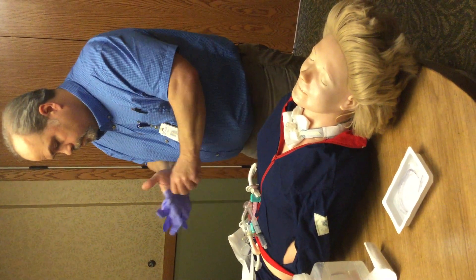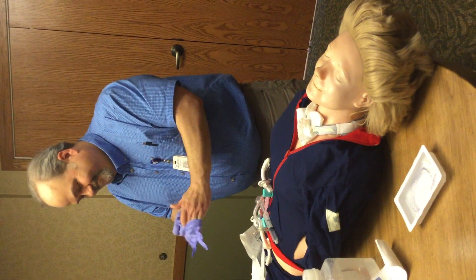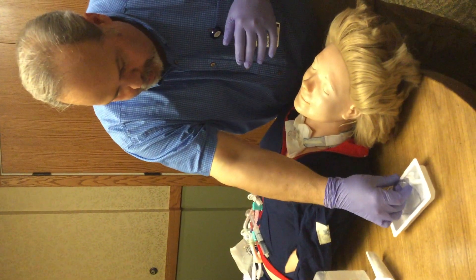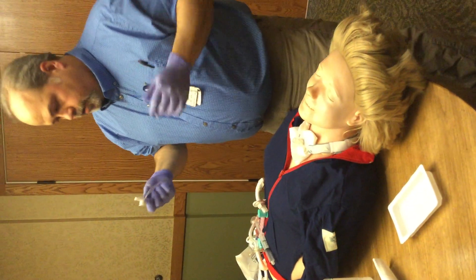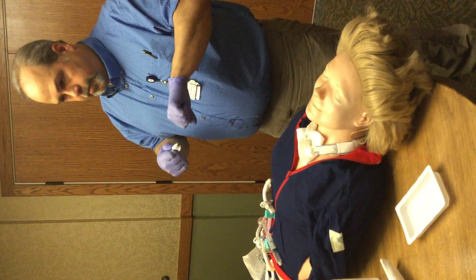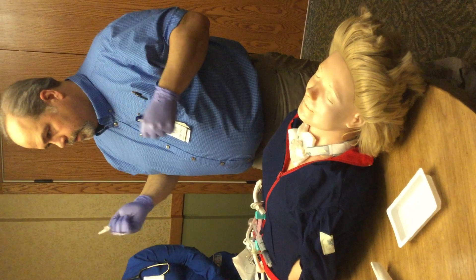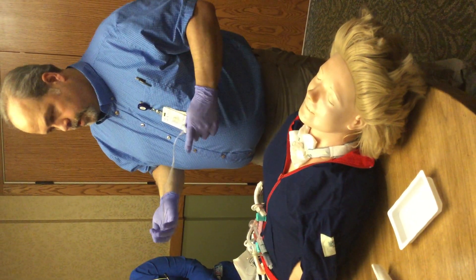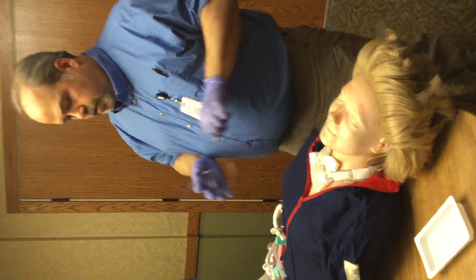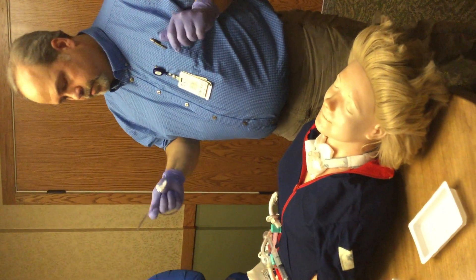Slip on your sterile gloves after sanitizing your hands. Now your hands are both sterile. Grab your suction kit. I usually wrap the catheter so that you're ready to hook up your suction tubing. Once you grab the suction tubing, the end isn't clean anymore. So whether you're left-handed or right-handed, you're popping it on and ready to go. I always keep my hands apart — it's easy to bounce into things. When you're not suctioning, wrap it up so it's not touching anything.